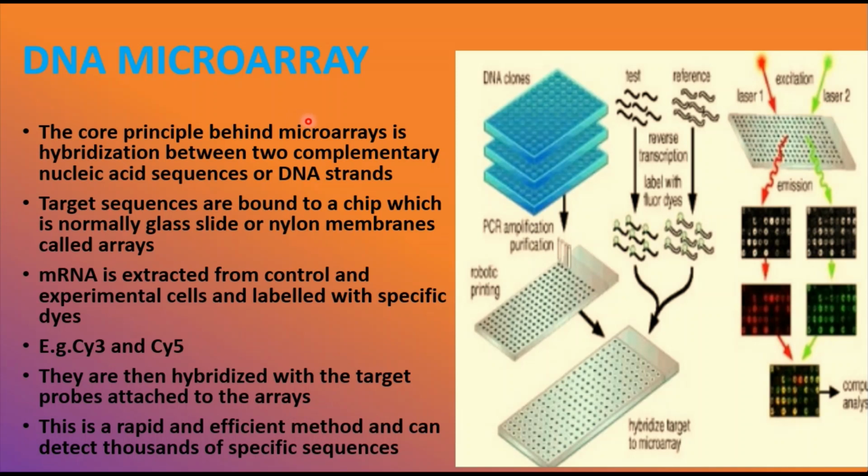So here the core principle behind the microarrays is hybridization between what we call nucleic acid sequences or DNA strands. The DNA or the target sequences are bound to a chip, which is normally a glass slide or a nylon membrane, called arrays.